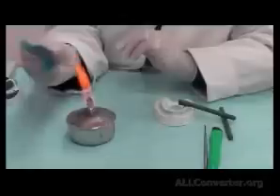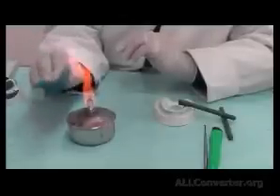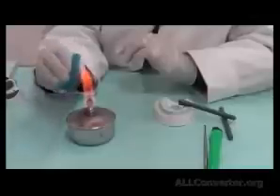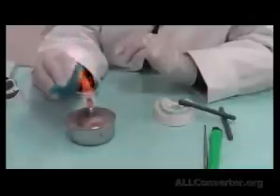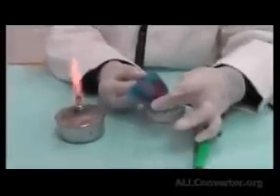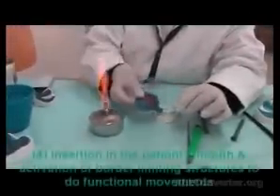So we need to reheat it on the dry flame. What will happen is that the heating itself will melt part of the surface, and we get this shine. You can clearly see it. So it becomes smooth and shiny, but I don't go into the patient's mouth immediately.